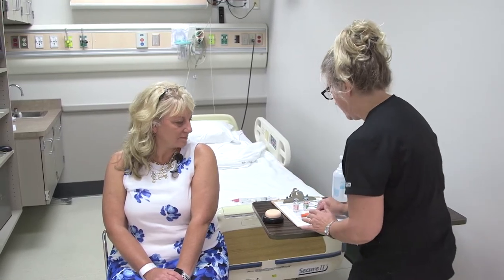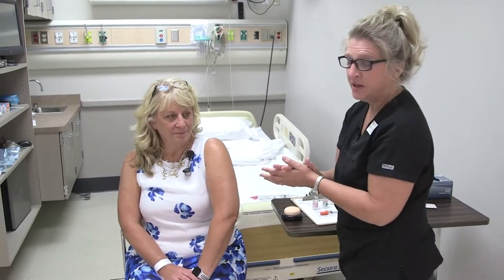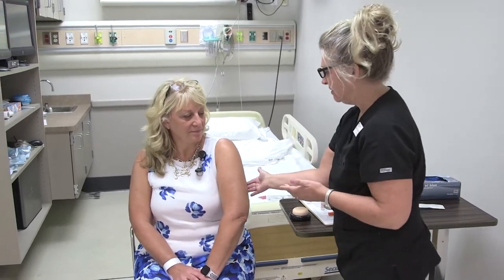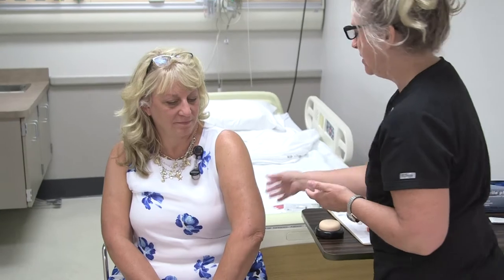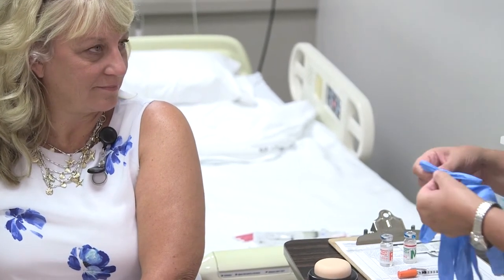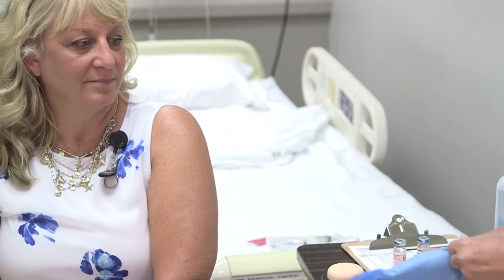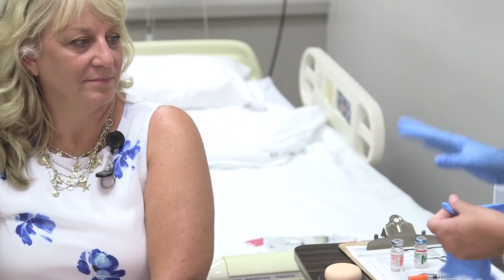I have my insulin and I'm ready to give it. I assessed the area and Sylvia agreed that we go ahead and give it in the left outer arm, so I'm going to wash my hands again. The area looks good — there's no bruising or scarring. She did get the insulin injection last evening in that same area, so I'm going to go in the same area and just rotate slightly around it.